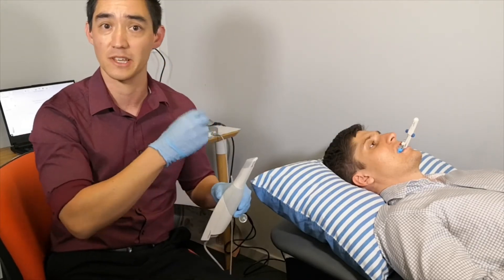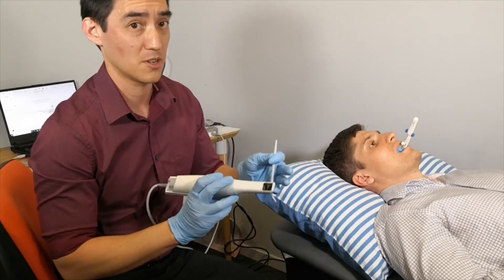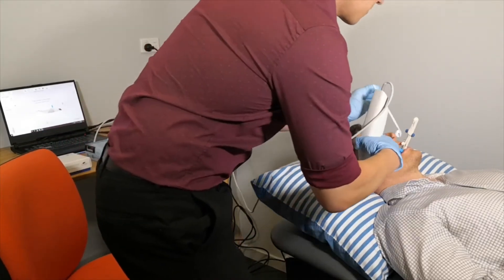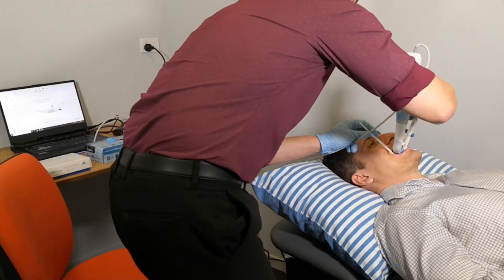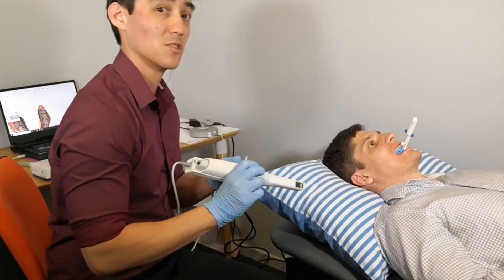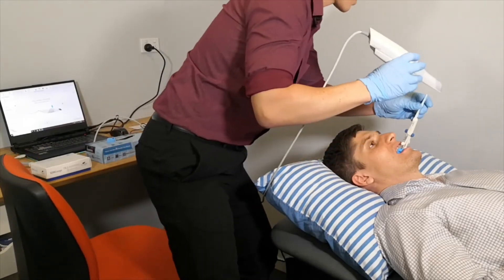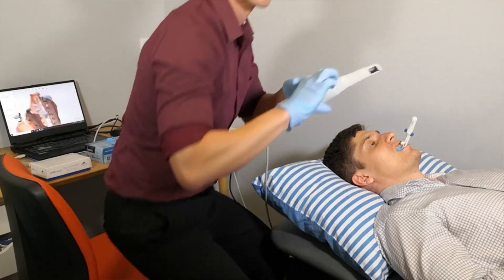We will scan both sides — it's always good to do both sides so that the software can line it up and you can see if there's any discrepancies in the bite. So I'm going to do the right side first. Just keep biting on that — I'm just going to squeeze my mirror down the side and then use the scanner. The software should line it all up for you and notify you once it's lined up. So that's the first one. I'll do the second one — just keep biting and I'll scan the other side. So that's the second one done.